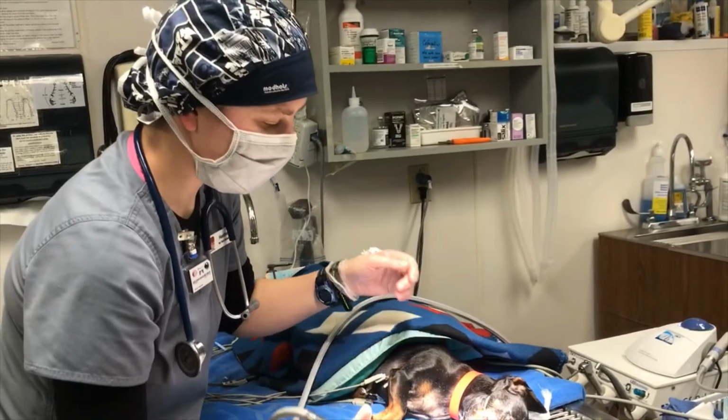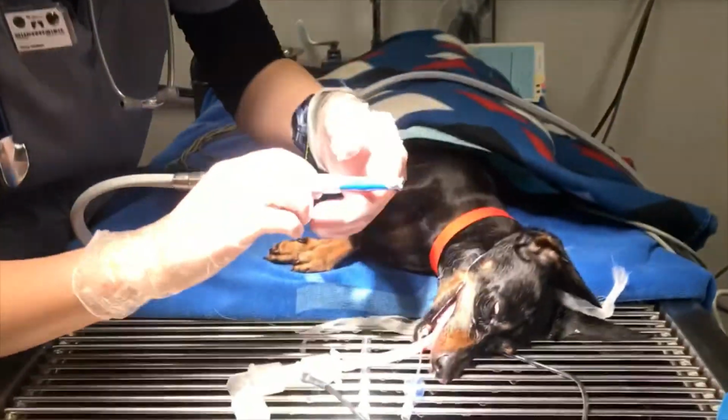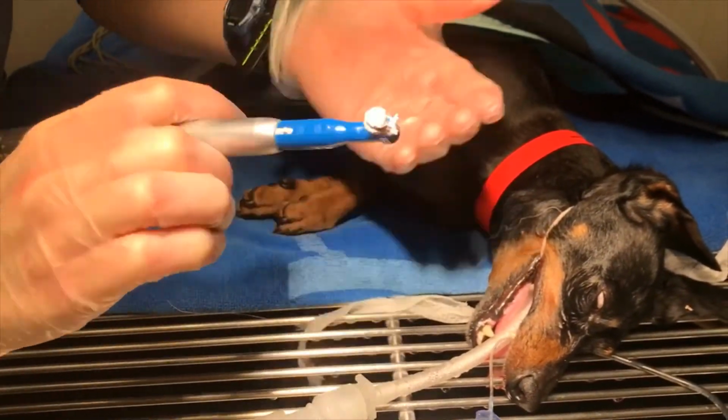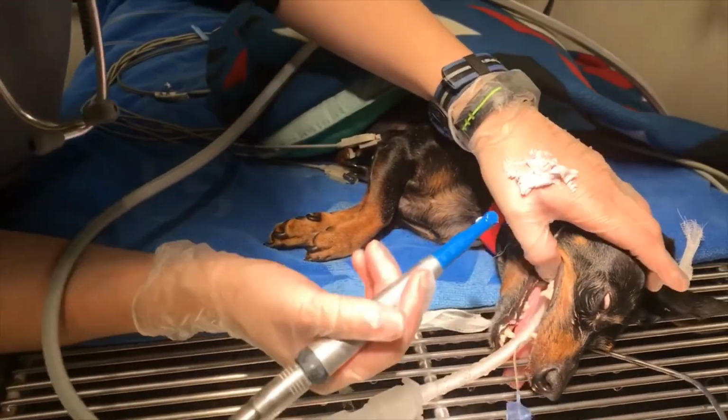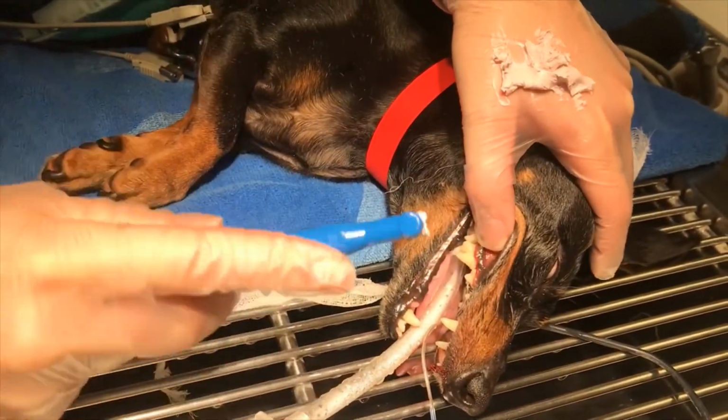So now that we have scaled Gemma's teeth, I'm going to go ahead and polish. You want to make sure you have a sufficient amount of polish on your prophy cup, otherwise you're heating up the tooth for no reason, as you do want to maintain that 10-second or less contact time for the same reasons.